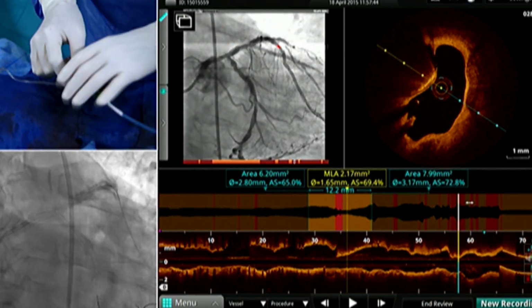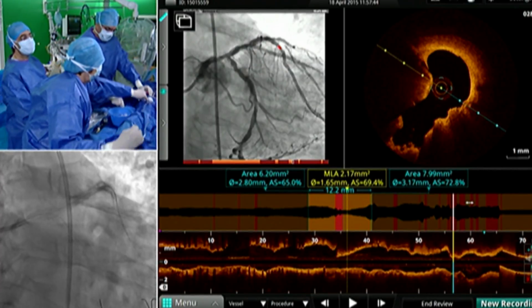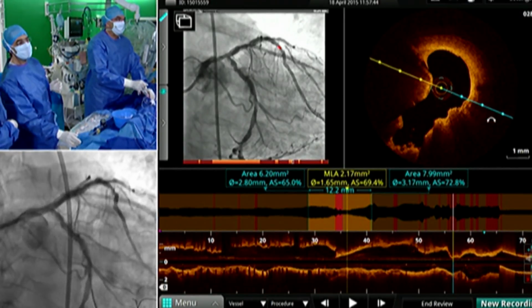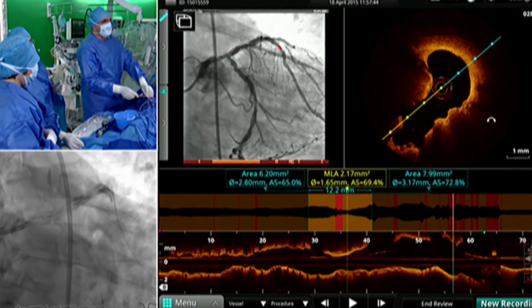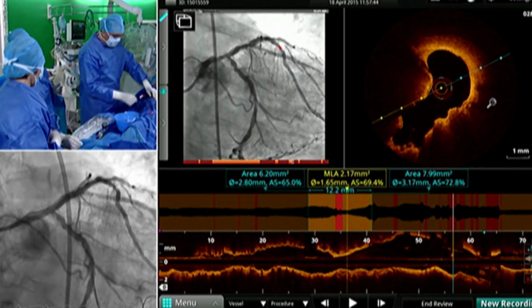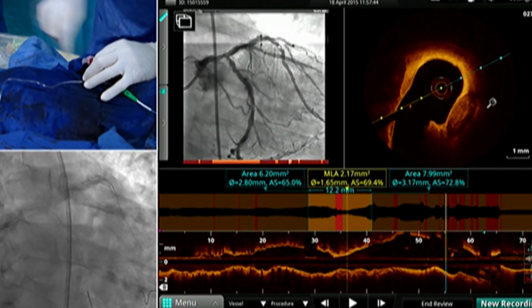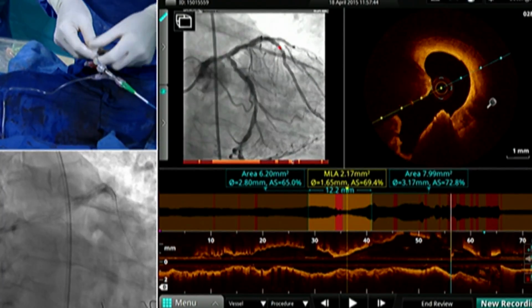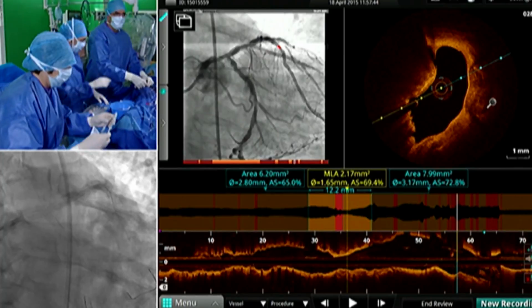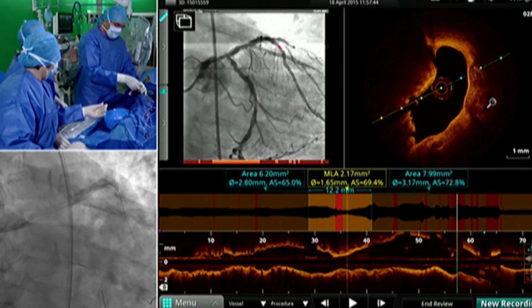Now we are entering toward the circ. You can see the circ at this point at 8 o'clock. And if we turn the axis while Jean is working, you can see in the longitudinal view the 3 branches, the left main, and then the intermediate branch coming off. This is the intermediate branch immediately afterwards. Huge calcification, but quite limited in terms of extension in the circumference. So definitely the lesion is there. It's, well, absolutely, yes.